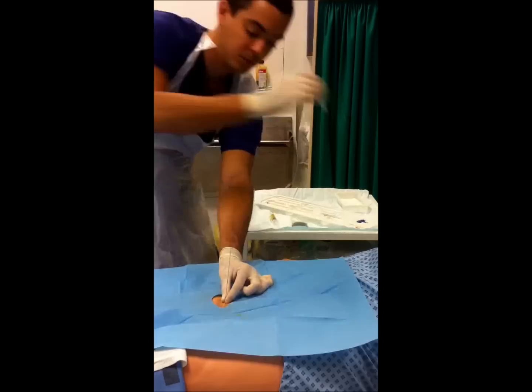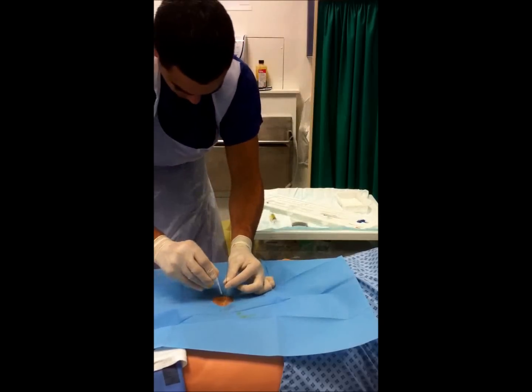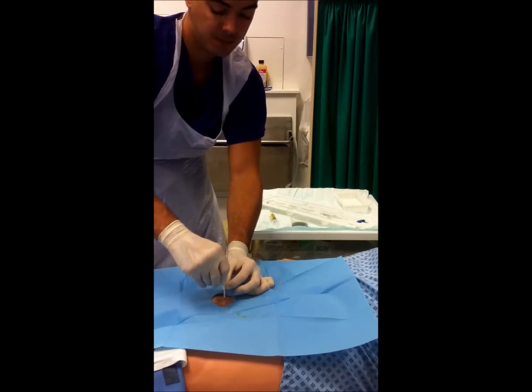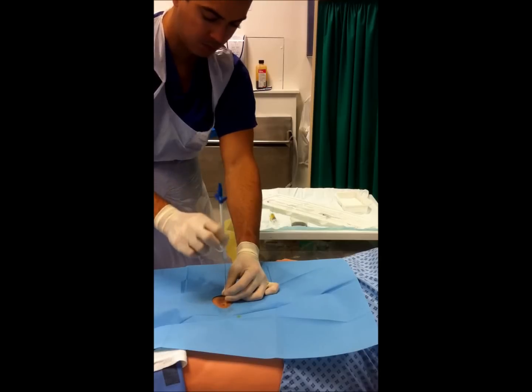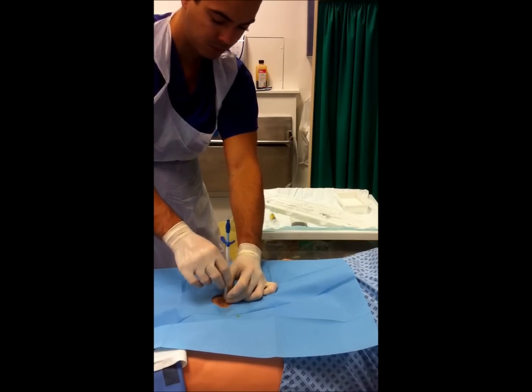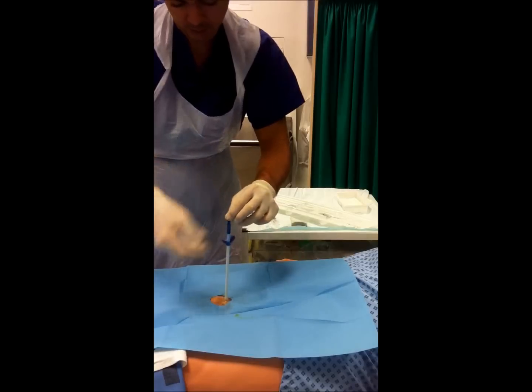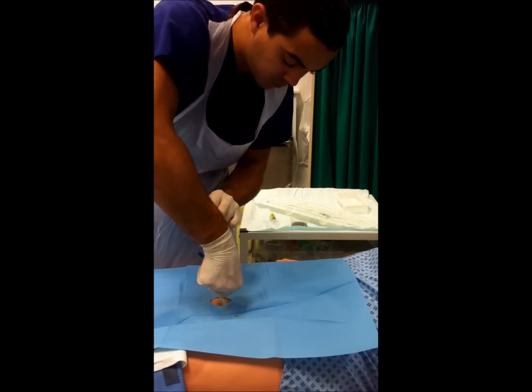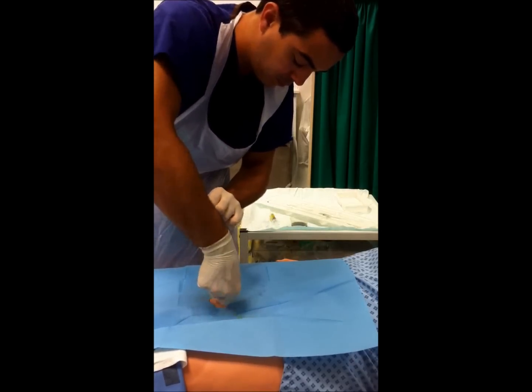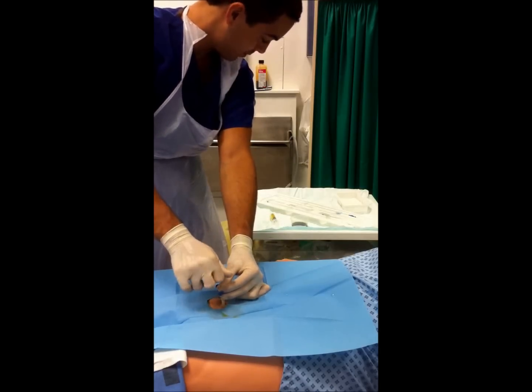Then use the blade to create a 1 cm horizontal incision along the wire. Place the trocar over the guide wire, ensuring to hold and secure the end of the guide wire. Advance the trocar with a twisting, pushing motion into the bladder, ensuring that the trocar and sheath are inserted to the second black mark on the guide wire.